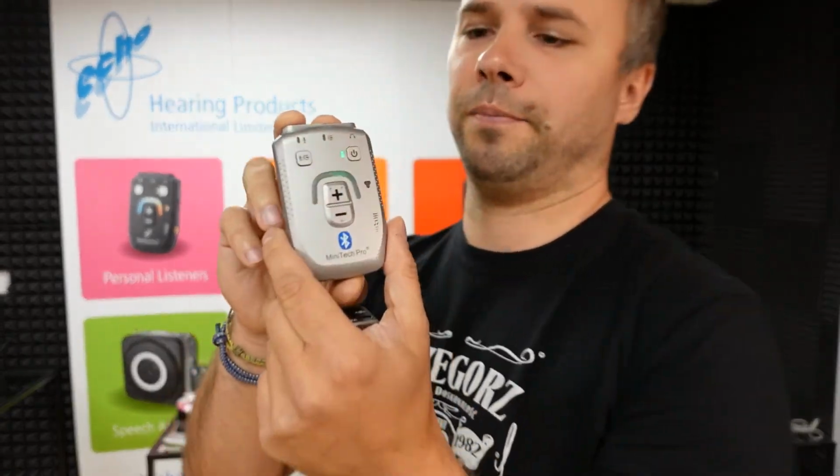Today I'm going to show you how to clear the memories on these two devices: the MinitechPro BT version and the Echo BT transmitter. Occasionally you need to clear the memories on these two devices, especially if you struggle to pair them for some reason. The easiest way to solve the problem is to clear the memories on these two. Okay, so let's start with the MinitechPro BT.